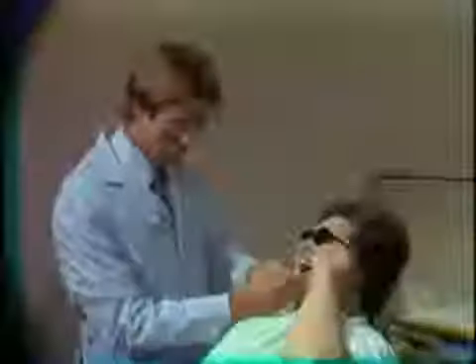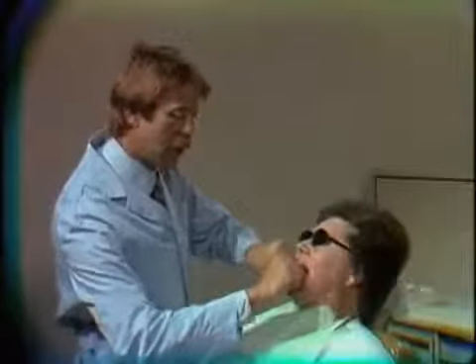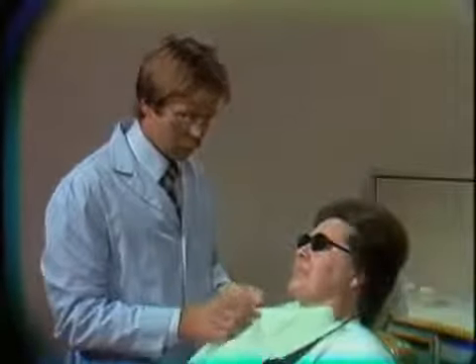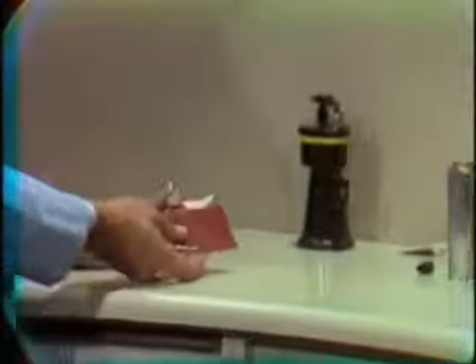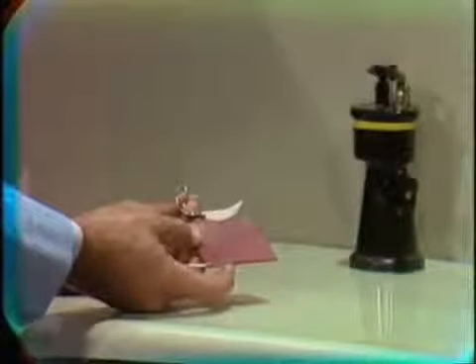Okay, you can remove this now. And I'll remove the appliance from the patient's mouth, and we'll then add the recording wax. Now, the wax that we use is a soft wax, but if it is chilled with ice water or with cold water, it is rather firm.